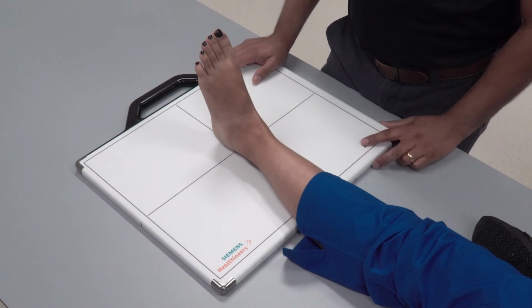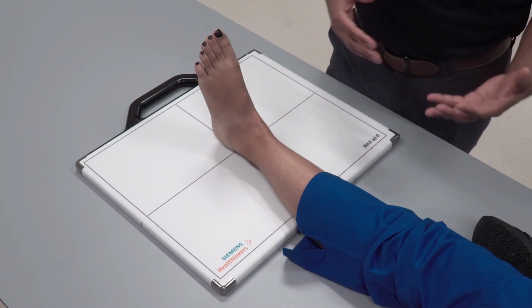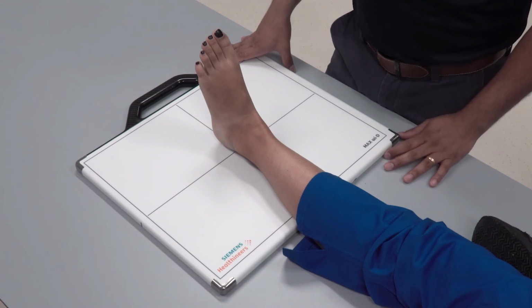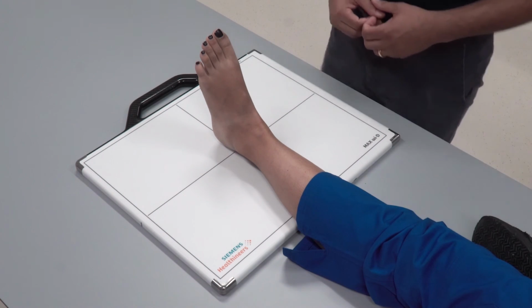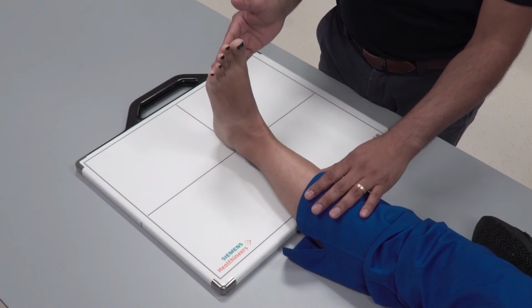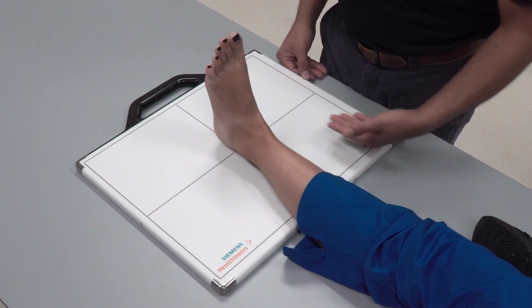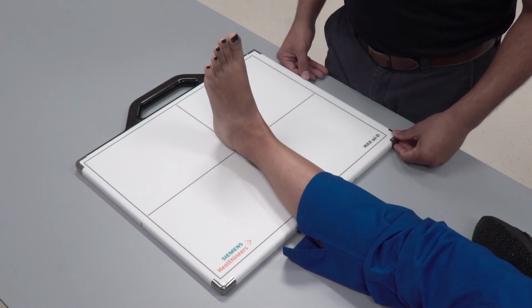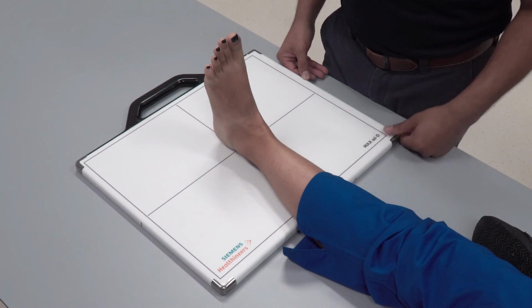So now let's take a look at positioning for an ankle view. 3 views of the ankle: AP, a mortise, and a lateral view. So positioning for ankle, ideally you want to do it weight bearing because you can see the joints in action, but we know that's not always possible. So we're going to do this supine. For AP view, you want to slightly dorsiflex the foot. The malleoli should run parallel to the detector, and you want to center your central ray at the mid malleoli.